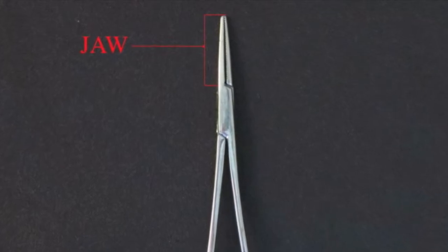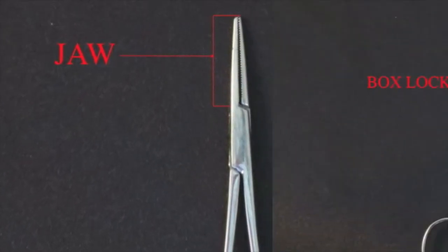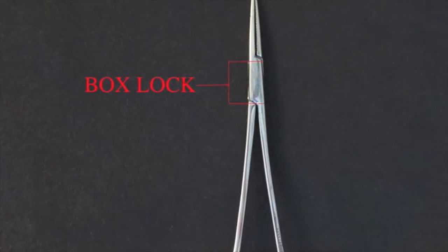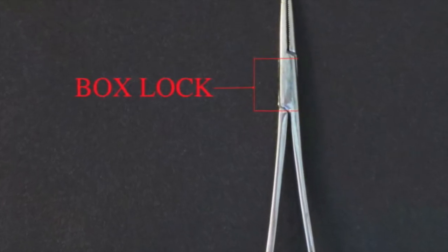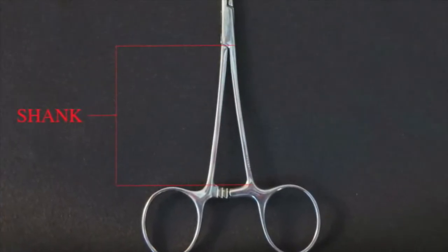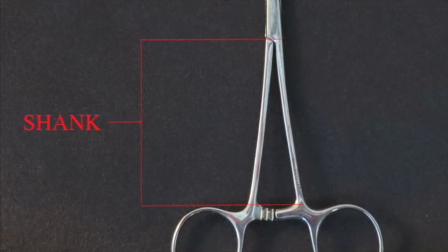The jaws are the working end of the instrument. The box lock joins the male and female shanks together and is connected at a pivot point with the pin. The shanks are the shafts between the box lock and the ratchet.